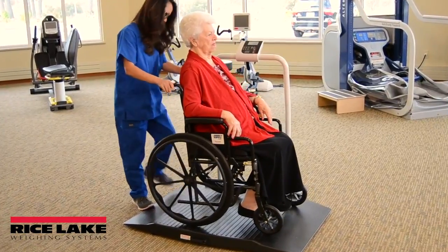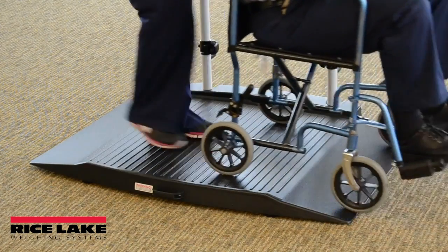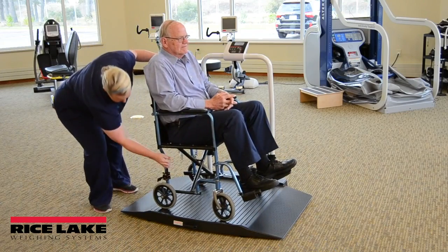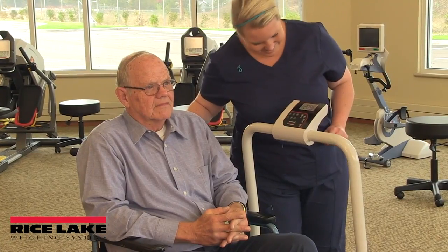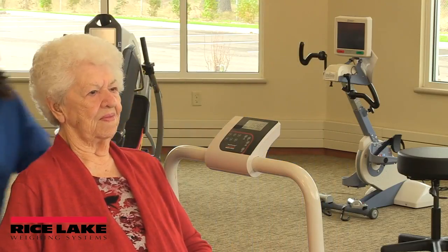Each model features a large platform to safely weigh all patients. Each scale uses motion trap movement compensation technology, which presents a steady, accurate weight reading even when patients cannot remain completely still.